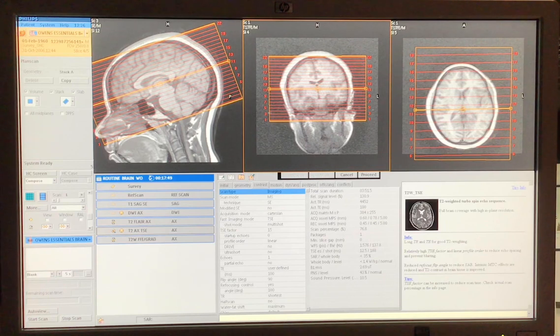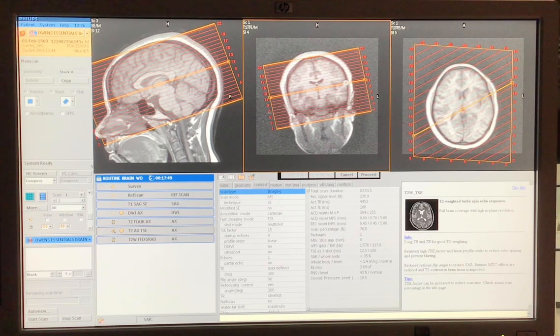So what I would do to get a perfect axial is to angle it where I can get a slice that's going right through. Let me pull up something here. Remember when we set up our sagittal going right through that falx cerebri? Let me show it in a different way. So we set our sagittals up like that.